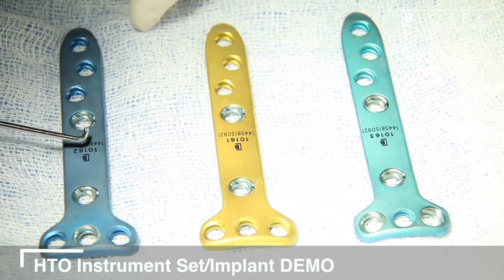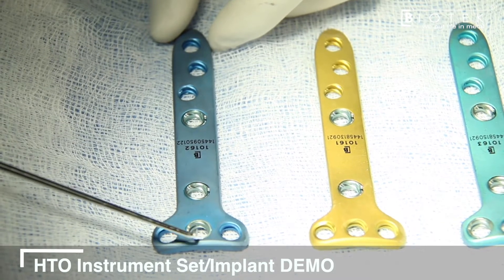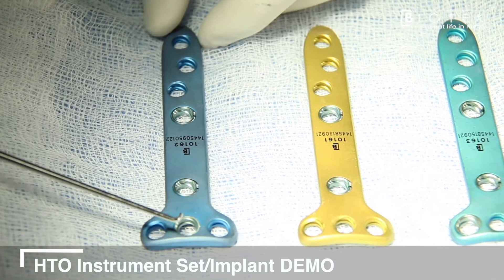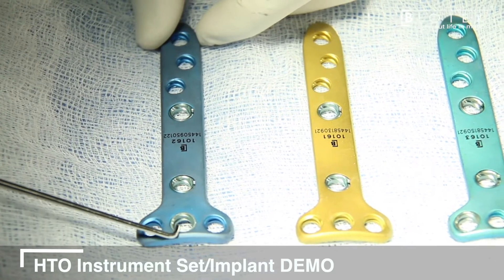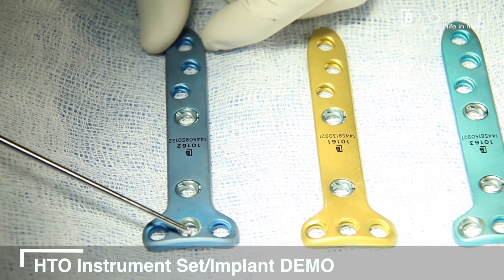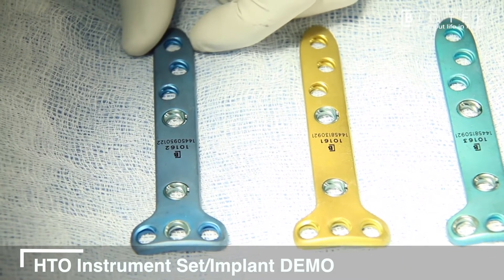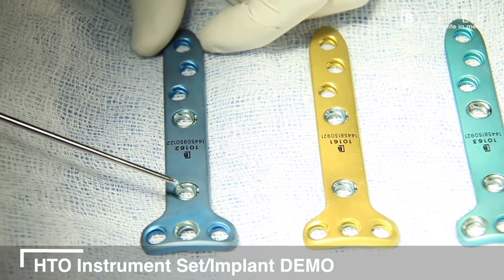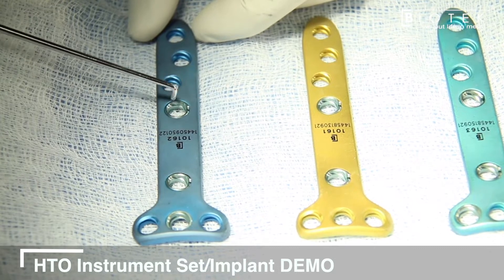The first variation of this plate is meant for a high tibial osteotomy performed along with an ACL reconstruction. The variation lies in the B hole, which is also a variable angle. In most cases of ACL with HTO reconstruction, the B hole tends to coalesce with the tibial tunnel of the ACL. Providing a variable angle here helps the surgeon prevent tunnel coalition of the B hole screw with the ACL tibial tunnel.